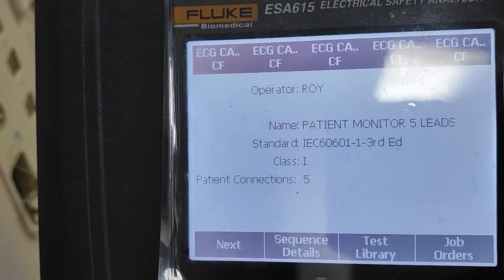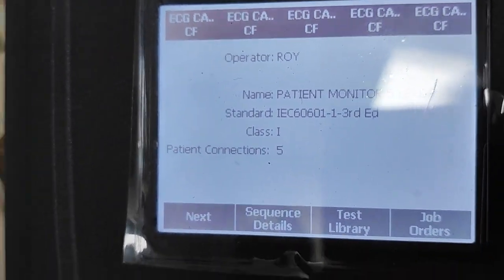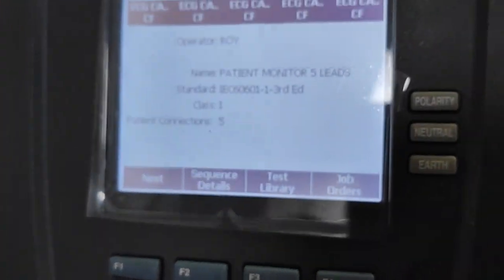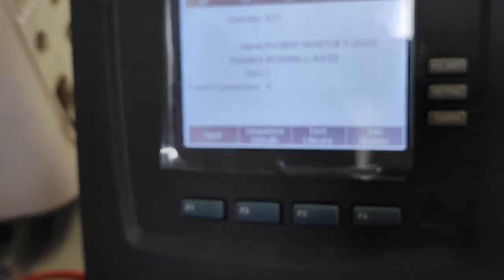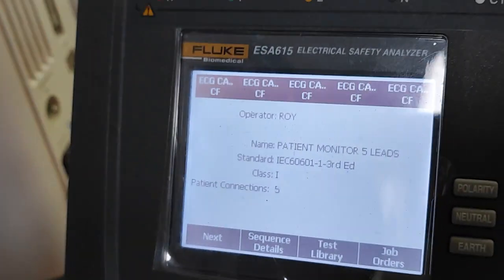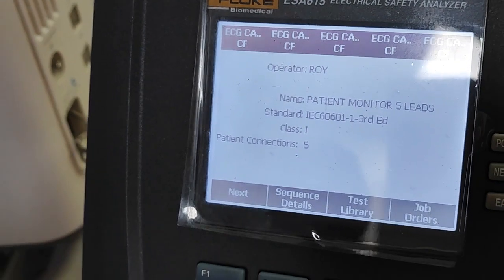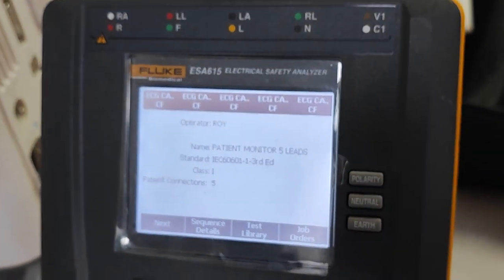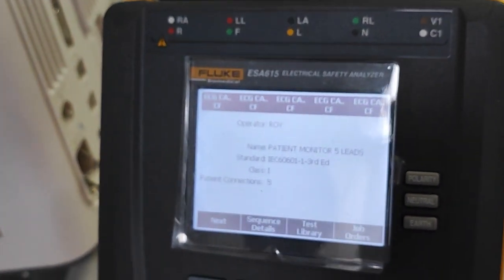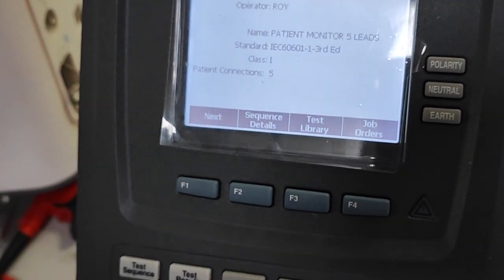You can also change the operator name — it's currently set to 'Mr. Roy.' You can change it to your name in the class settings. All biomeds can add their profile there. If you want to use it, just change the name — it will save automatically. Then remove and disconnect.